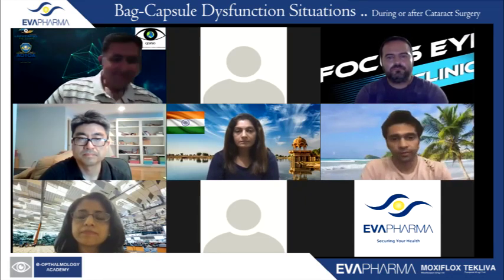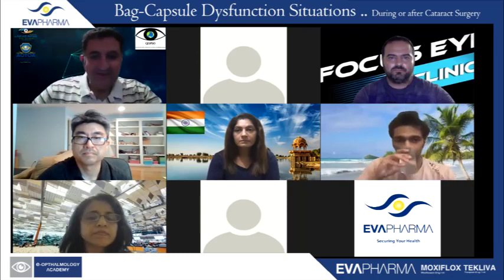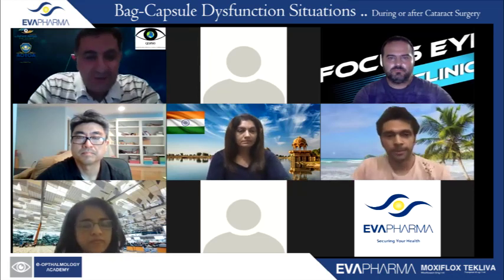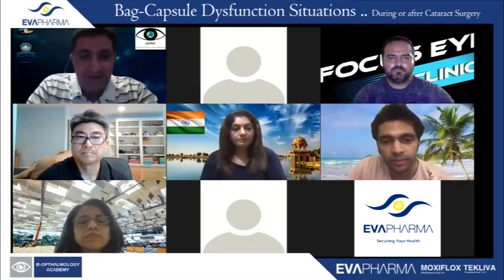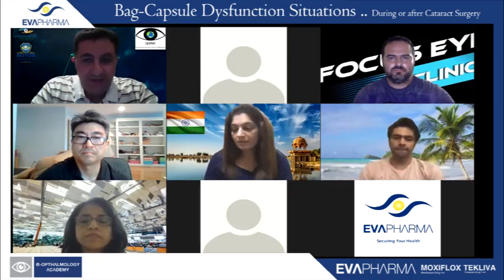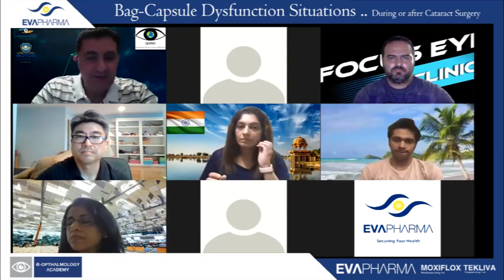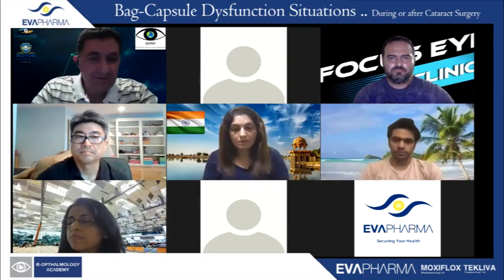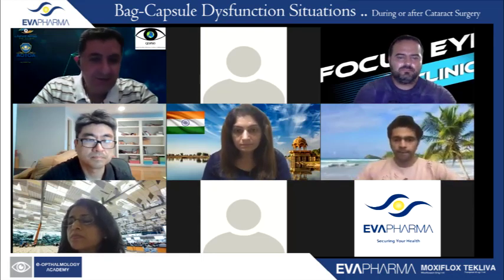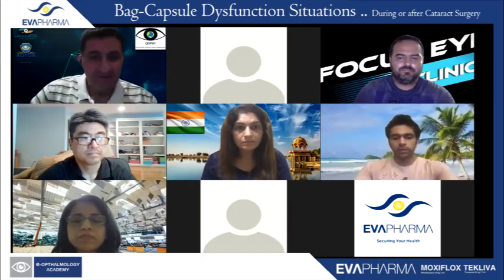Ashraf? Yes. Now we are going to move to one of the talented surgeons, Priya from India. She's going to talk about the glue technique, IOL, as one option for the situation where we don't have a bag and we want to fixate the IOL to make the patient pseudophakic, not aphakic. So go, Priya, please.